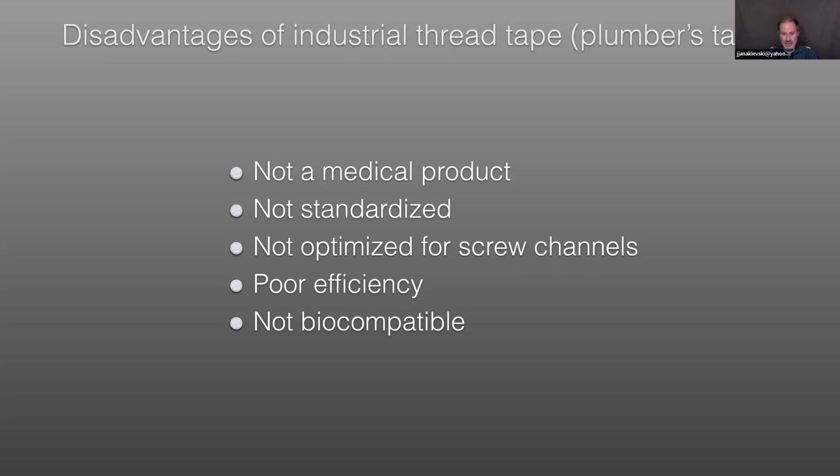They're not biocompatible because they're made in industrial facilities, open air facilities, on dirty machinery. They have residual solvents and impurities in the product, which is not important for industrial use, but it becomes important when we think about it for our patients, for medical applications. The material also isn't optimized in terms of its properties for packability and removability, so it's not as efficient.